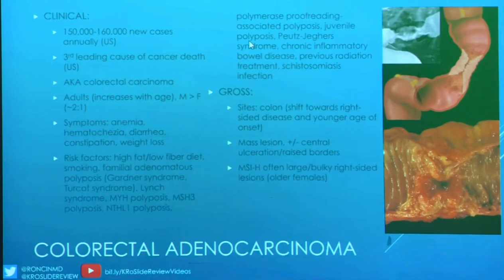They are fantastic. So what we see there is a very large fungating type lesion that's really taken over the entire circumference of the colon. And on the inset is, what do they call that? I lost the words. Barium. Barium, thank you, a barium scan, which yes, they do by enema. And what that's showing you is that apple core sign. So what you're seeing is really the space that's left that the cancer hasn't eaten up. And the empty space, or the apple area, is actually occupied by the tumor.